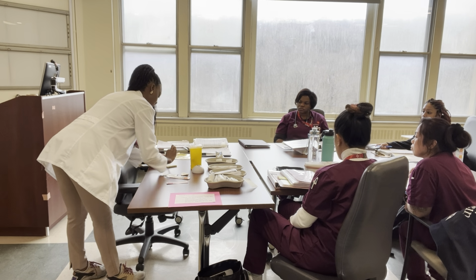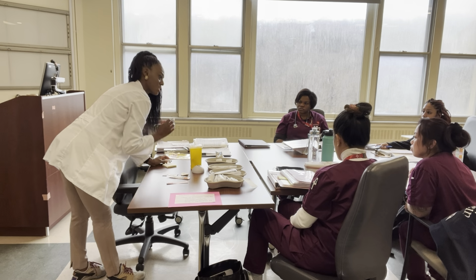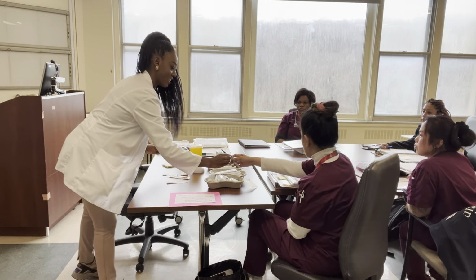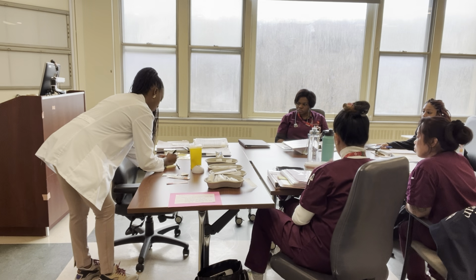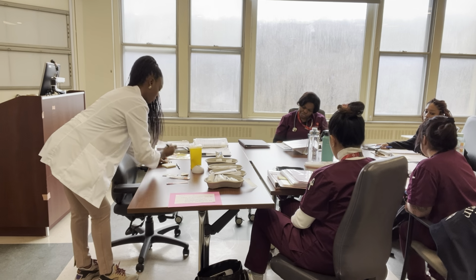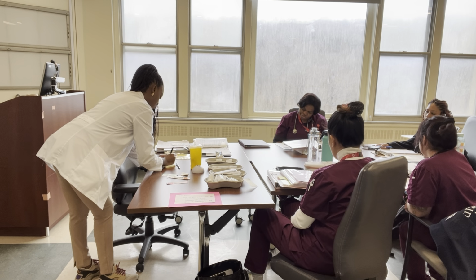So I would write on here if I had a felt pen. Does anybody have one of those Sharpie pens that writes? Mine, I can try, you do? Thank you, I'm going to borrow the Sharpie. So I would have to write it in, so we know it's for October the 6th, but we're going to use today's date, whatever date. Where are we today?